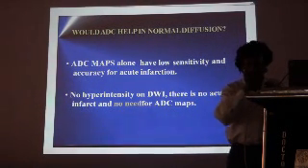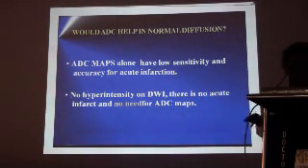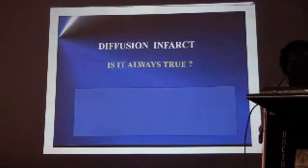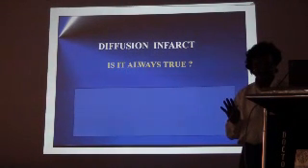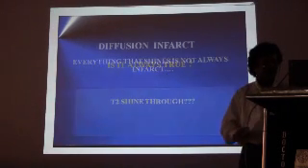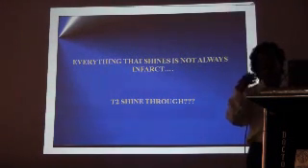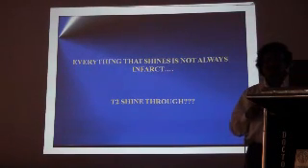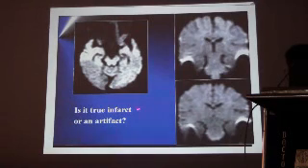Okay, I'm coming again. There are a lot of issues with diffusion. So diffusion equals infarct. Is it true? Everything that shines is not always gold. But these are the problems. Is it a true infarct or an artifact?